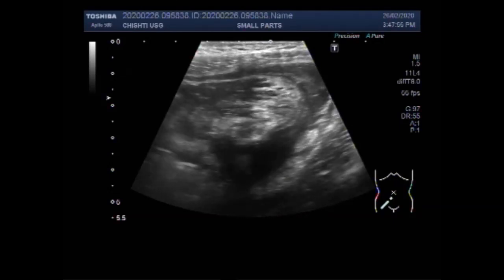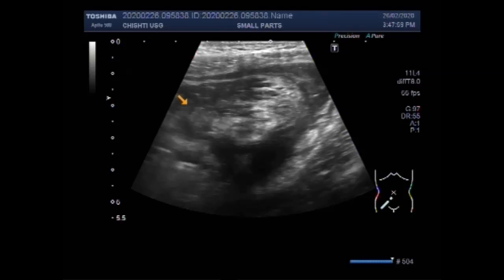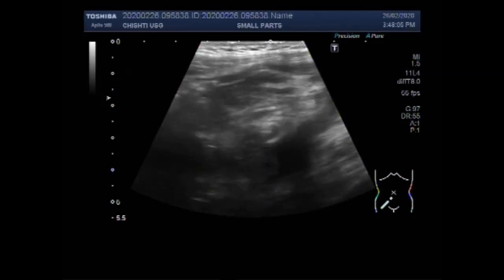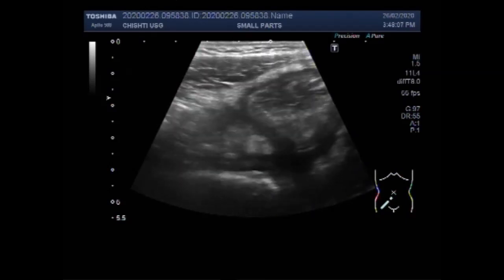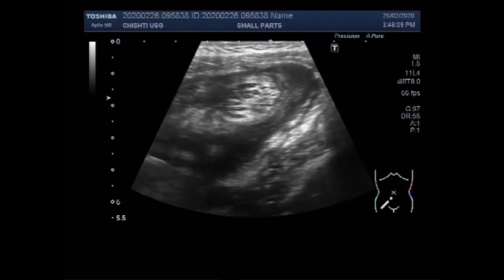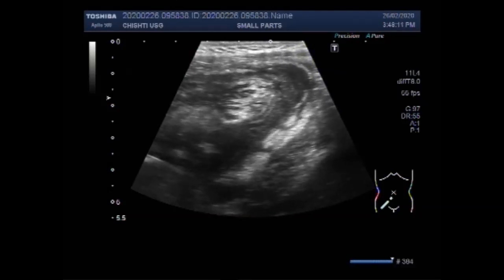You can see the gut loops and the right iliac fossa, and a significant amount of thick free fluid is seen along the gut loops.